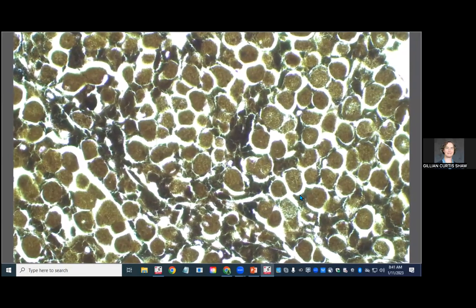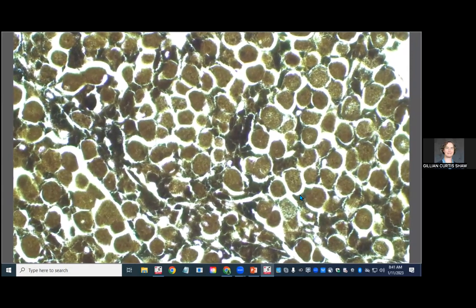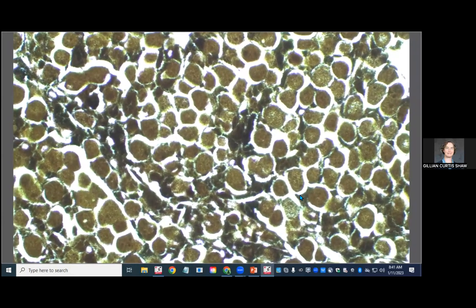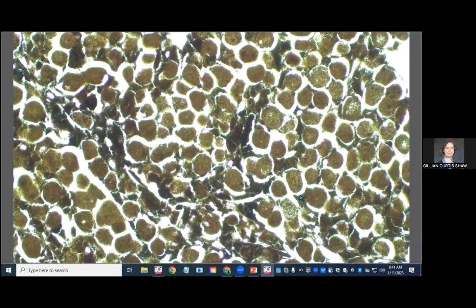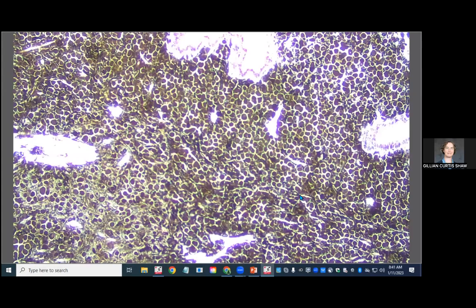So we have definitely what we would call a double cell population, which is typically a buzzword or phrase that makes us think of a melanocytic tumor. However, in this case, we don't really have a discrete mass. In this case, we concluded that this was melanosis and not an actual melanocytoma, at least in the examined section, that caused this diffuse expansion of the uvea.